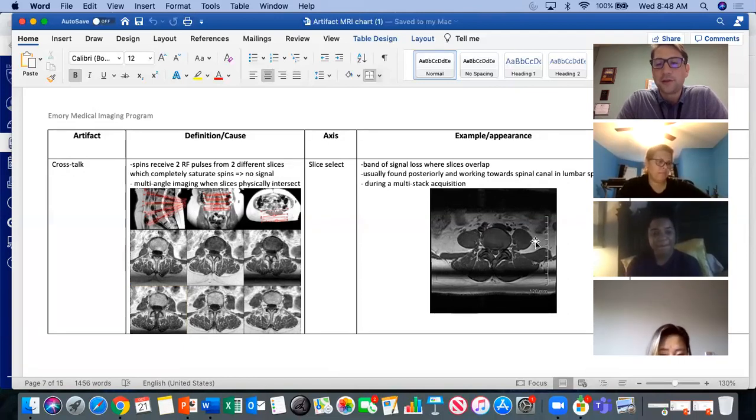So this is one of these judgment calls. If you have a patient that can't withstand any more imaging, you might hold off on possibly doing another T2 axial till the end. But once again, you're not really in the anatomy of interest. If there was a tumor back here on this spinous process and you missed it because of this banding artifact, that would matter, but what they're looking at on these axials is really in this area. We are looking at the spinal canal, and how those nerves leave through those foramen right here.